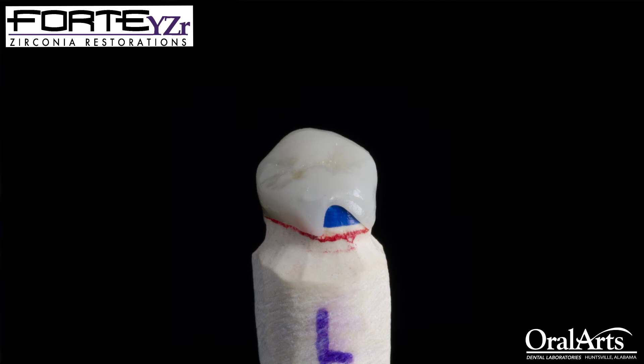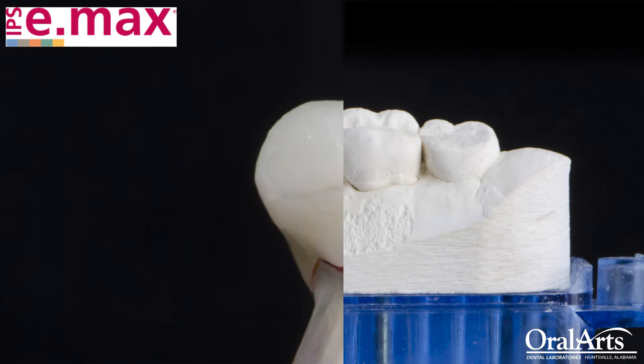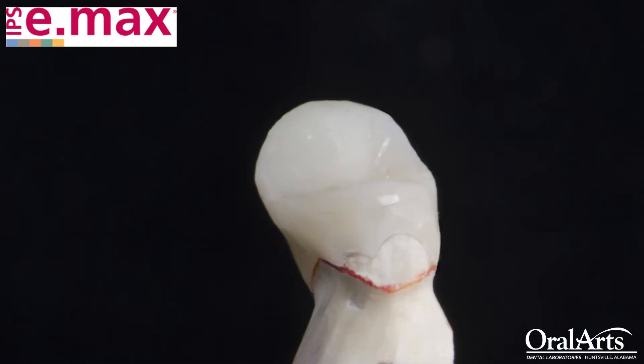This could be mitigated, and our 1% or 2% could go down to zero if customers would focus on prepping a slight chamfer. You don't have to be as aggressive as you would for an Empress, but we still prefer to see a chamfer. We have an Emax restoration that came back broken, and once again it's on the lingual where you have a lot of biting forces opposing that cusp. Again, it just fractured on the margin — it's a minimal prep, and this is the result.